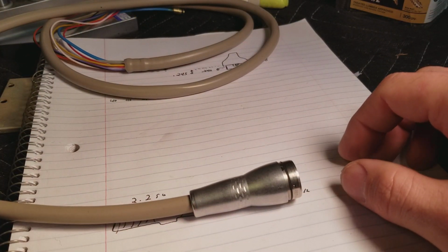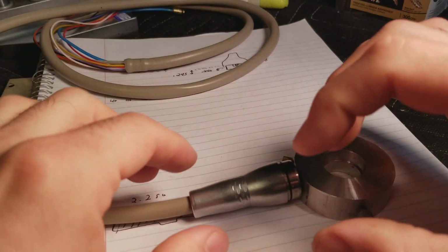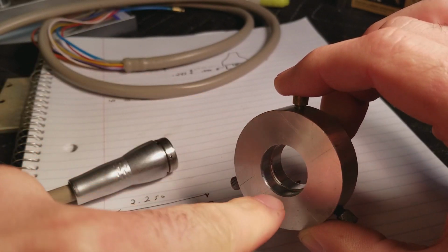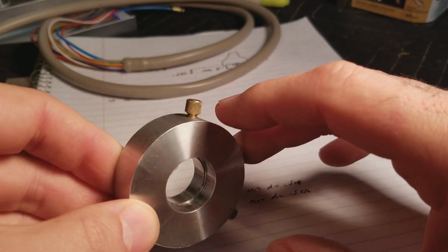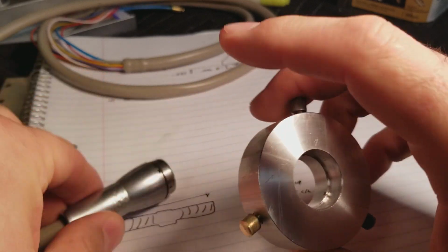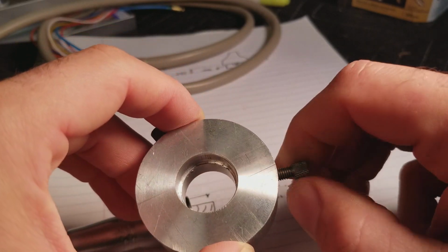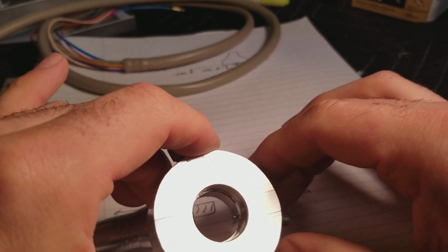So I'm going to show you how I went about doing that. Basically, I knew we needed to have something that grabbed into each of those little window areas to hold that inside piece tight while you could unscrew the back part. So I took a piece of aluminum and machined out a little lip here, as you can see, which allows the cable to fit into here, stops at exactly the right point, and then there's these little holes that I put in the sides that correspond exactly with where this window would be. And then we made these screws that have a pin that protrude out like so. It goes into this threaded piece on the outside and then fits right into here. And then you simply screw this in, and you'll notice that pin comes out right there to hold that inside piece stable.